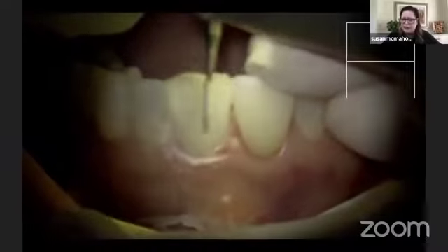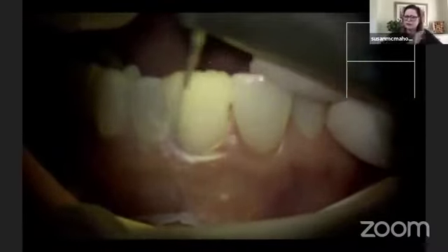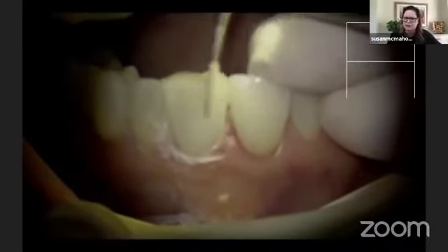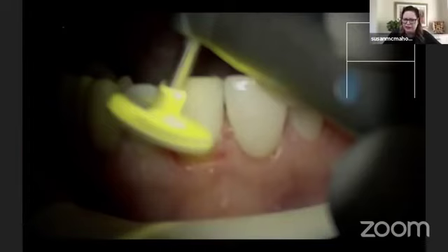This patient doesn't have deep lobes, very light lobes. But what she did have was deep striations. She had deep lines going across that composite, so I'm going back and forth making those deep lines. The deep lines are in, most of the composite is done, and now I'm going to finish.